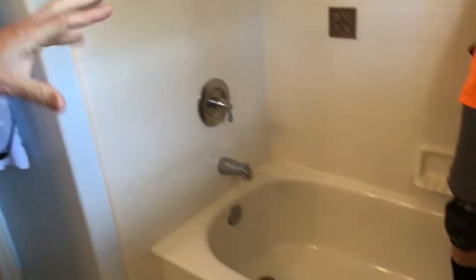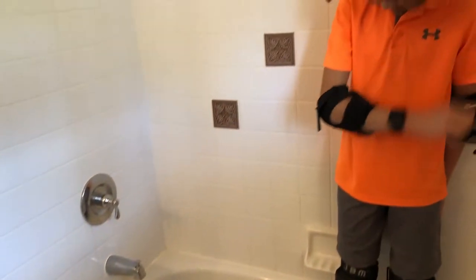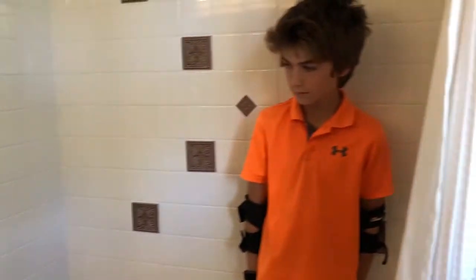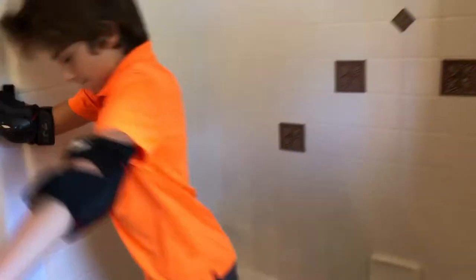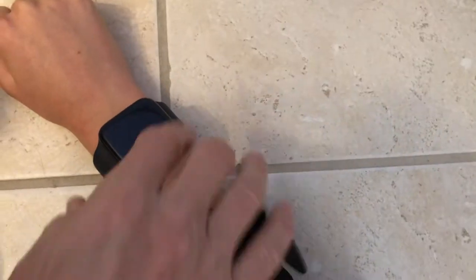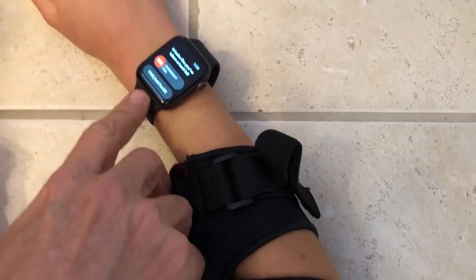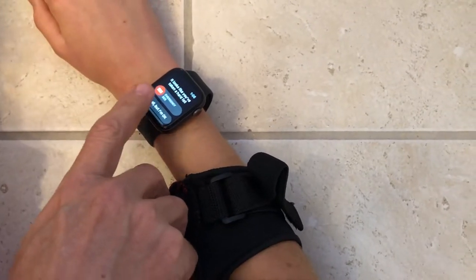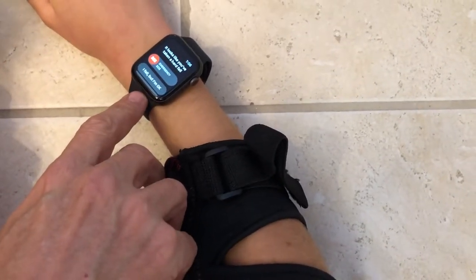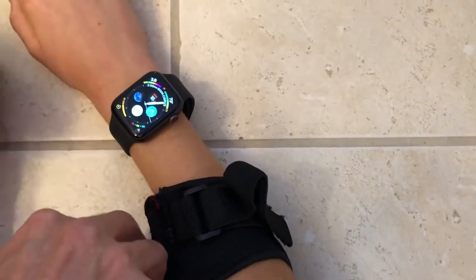Now we're actually going to test a high threshold — that's a shower-tub combination, a dangerous combination because it is a high step to get out of and a slippery tub. Andreas, let's go ahead. And we should get a detect with that. We got a detect. 'I fell, but I'm okay,' or SOS. SOS means you're going to contact whoever's on the watch as an emergency, or 'I fell, but I'm okay' will reset the watch.